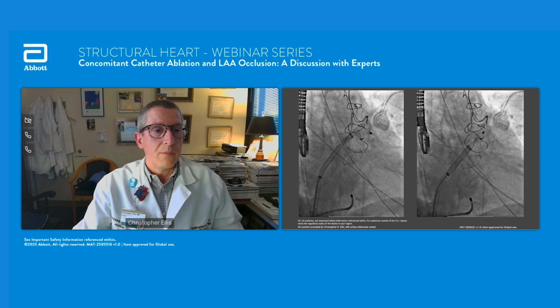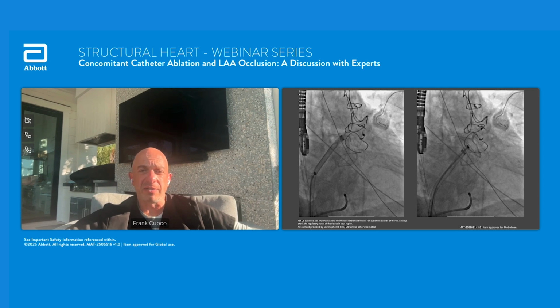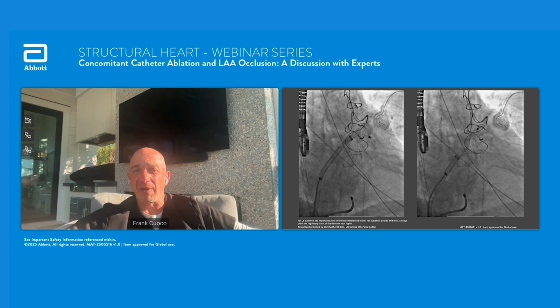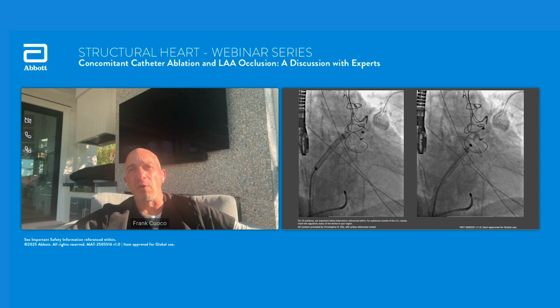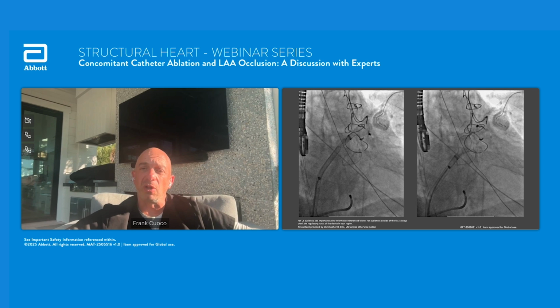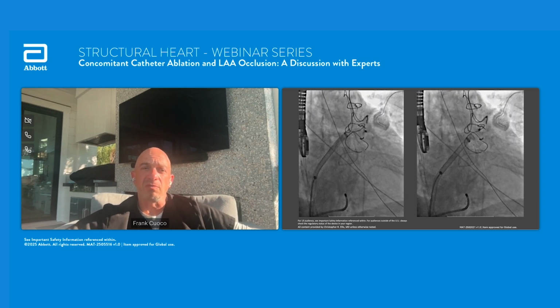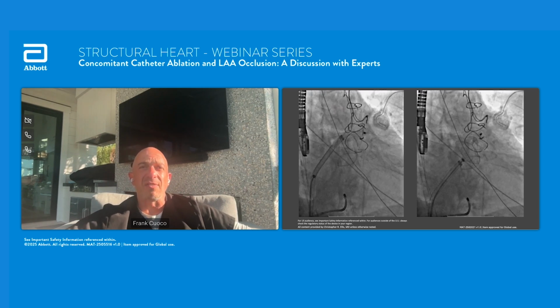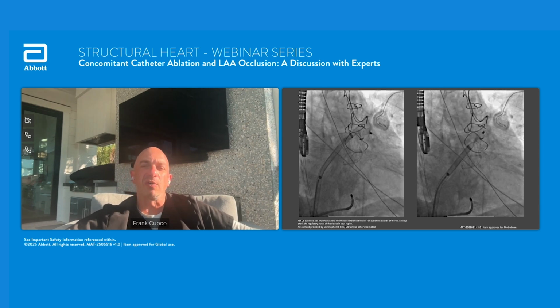So that's a really good point, Chris. I think transseptal location depends on the ablation modality you're going to use. That might actually impact what ablation modality, what product I use in the future, because obviously with focal PFA catheters, that may be less of an issue in terms of being more mid or higher with your stick, because you don't have a large, flower-shaped form factor to deal with to get around the right inferior pulmonary vein. If you have a focal catheter, it's obviously still somewhat of an issue, but a little less so.